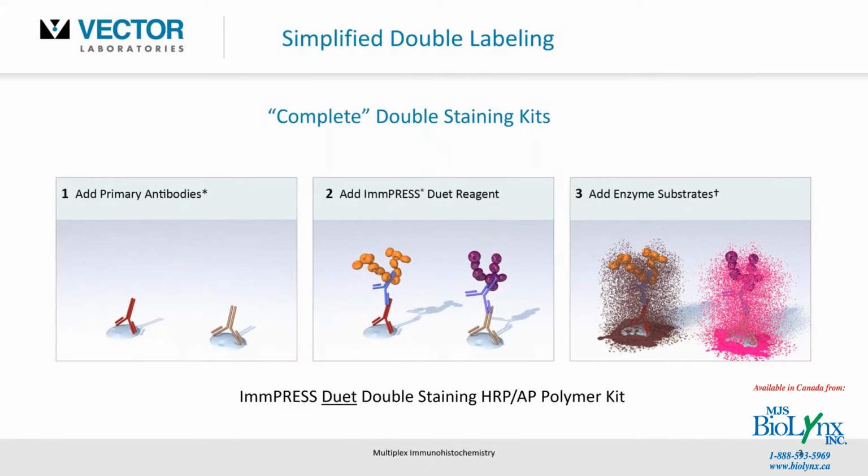All you do is add those primary antibodies. The other caveat would be just to ensure that those target antigens aren't completely overlapping at their site of localization. And that's a topic that we'll discuss a little more in depth at the end of the webinar here. But indeed, if you do meet those given criteria in your lab and you're new to the field, have a look at one of these kits. It'll get you up and running very quickly and reduce optimization time at your end.